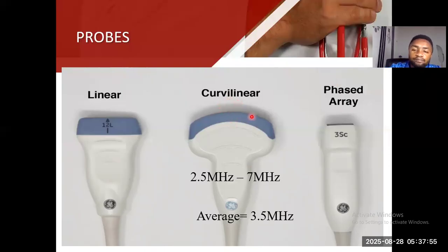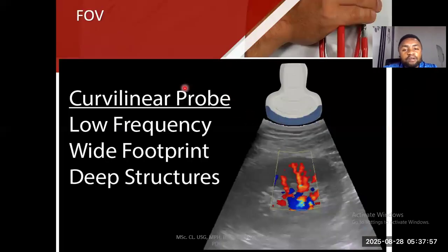Okay. All right. Now the field of view of curvilinear, you see the field of view, it's wide. Yes. We know that it has low frequency, wide footprint. You know the footprint because you have done physics. Wide footprint. It widens like that.